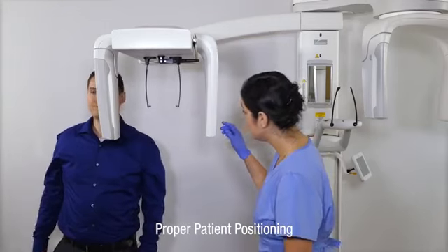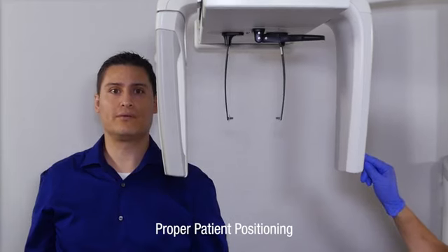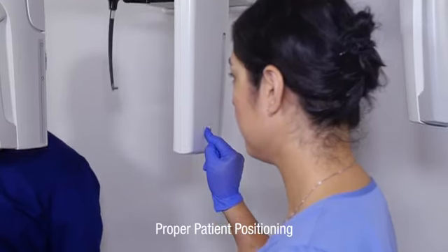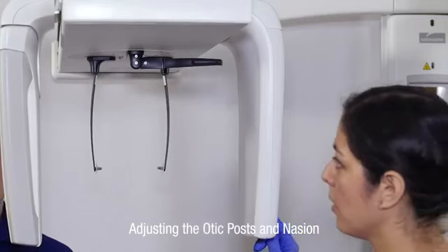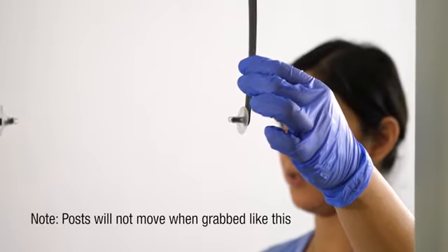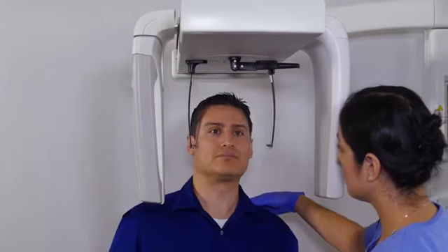With the patient standing next to the unit, visually compare the height of the patient's otic canal with the cephalostat ear posts. Adjust the height of the cephalostat until the ear posts are approximately the height of the patient's otic canal. Grasp the otic posts at the top and move them out to position the patient. The posts are designed so that they will not move except when grasped at the top. Next, rotate the nasion marker up and help the patient to enter the Ceph.